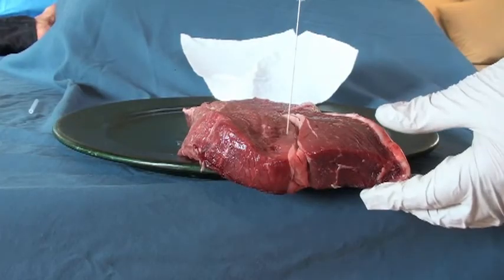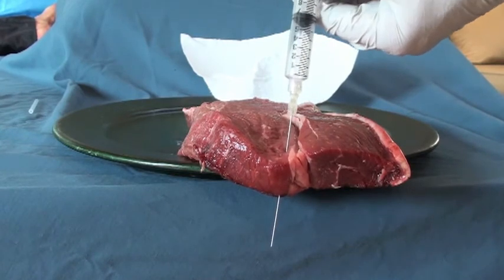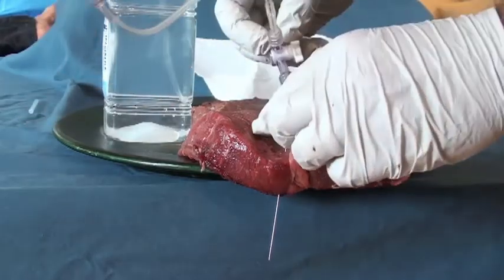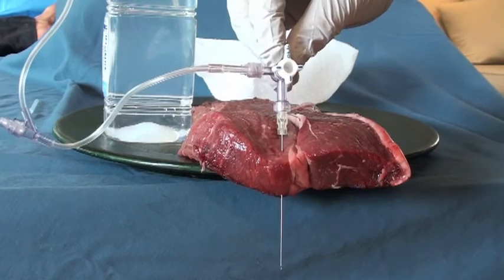You can also use an LP kit — just use the spinal needle instead of the angiocath. Those also have a nice long needle and a three-way stopcock, and just about everything you need to save a life.